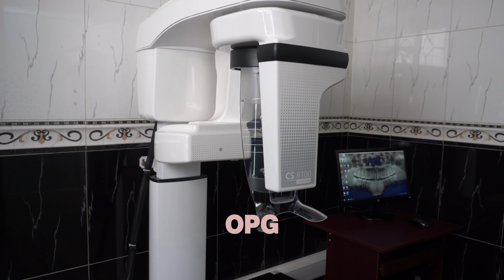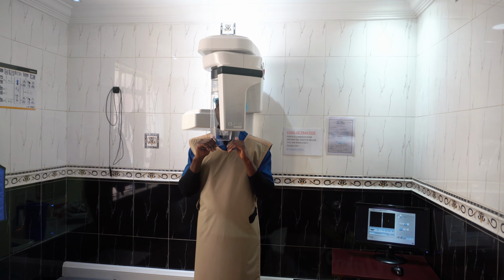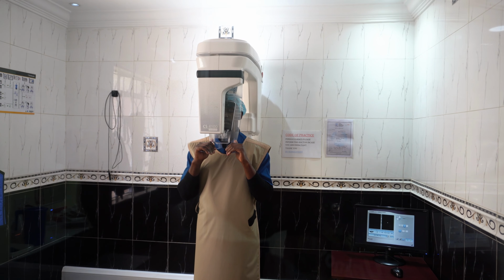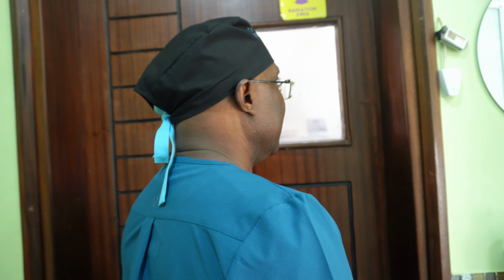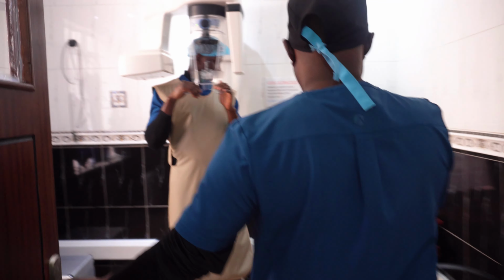The second x-ray I mentioned is the most common one that we take at Tender Care, an OPG, or a panoramic x-ray. The machine goes around your head and takes an x-ray of all your teeth, all the jaws, the sinuses, and that kind of thing. So that one, we are able to see a panoramic view. We are able to make diagnostic information.